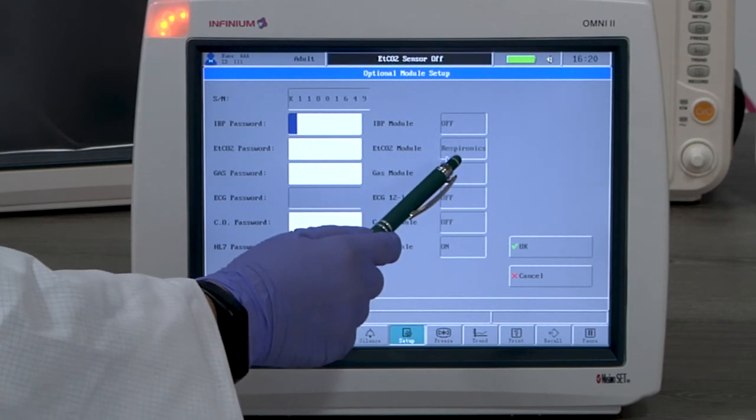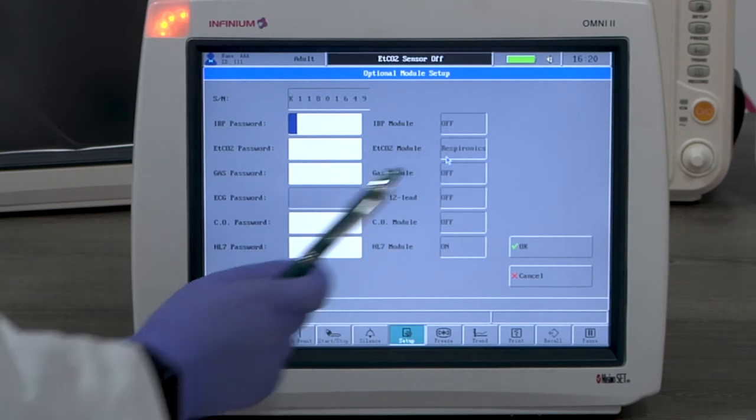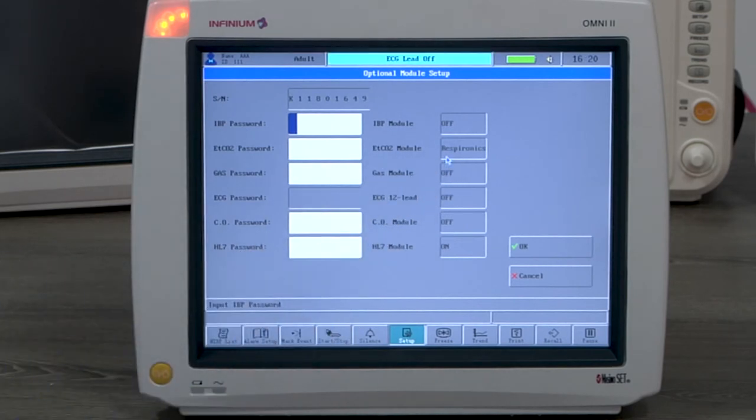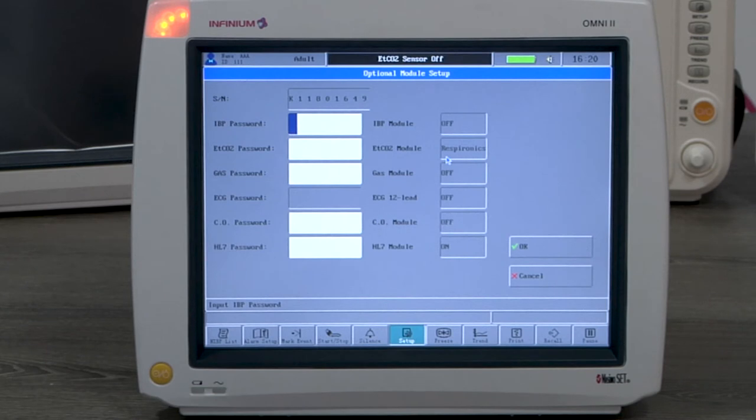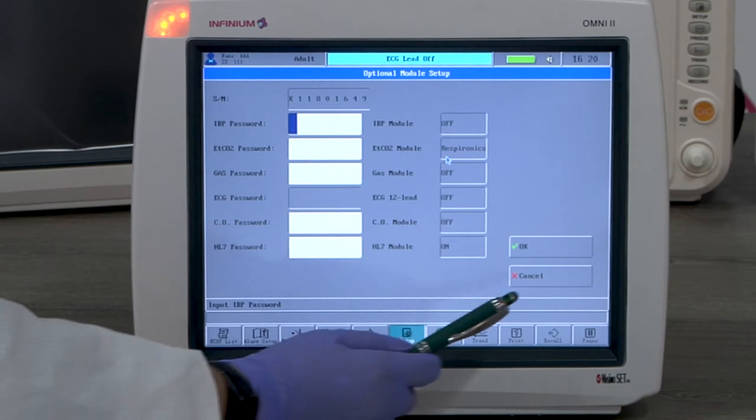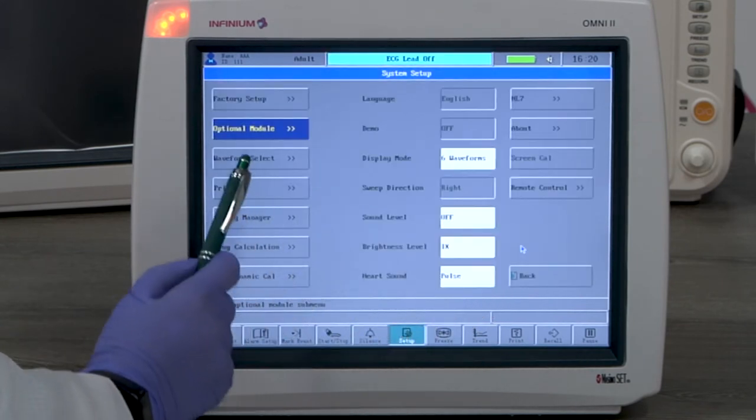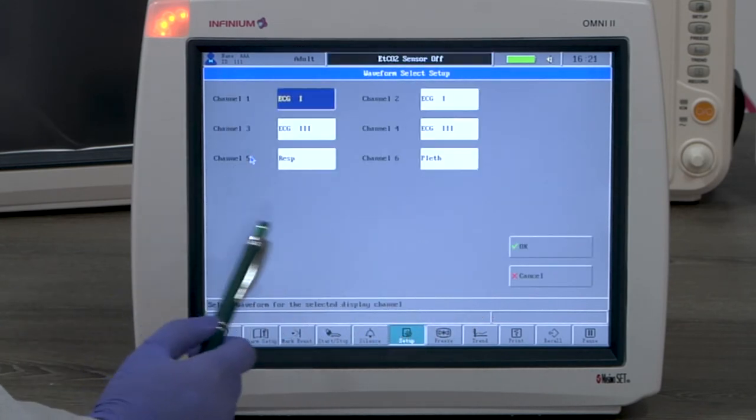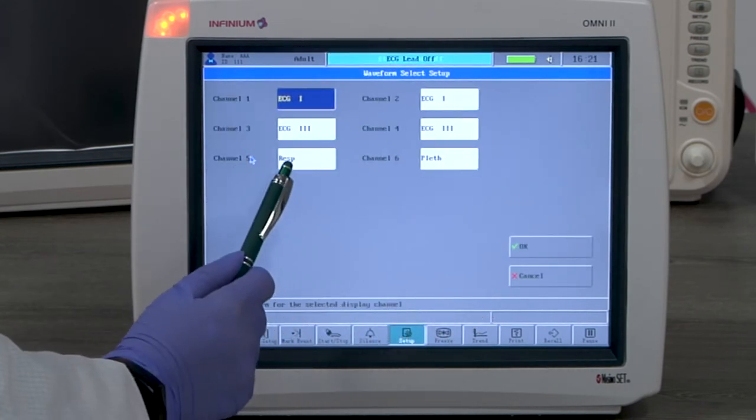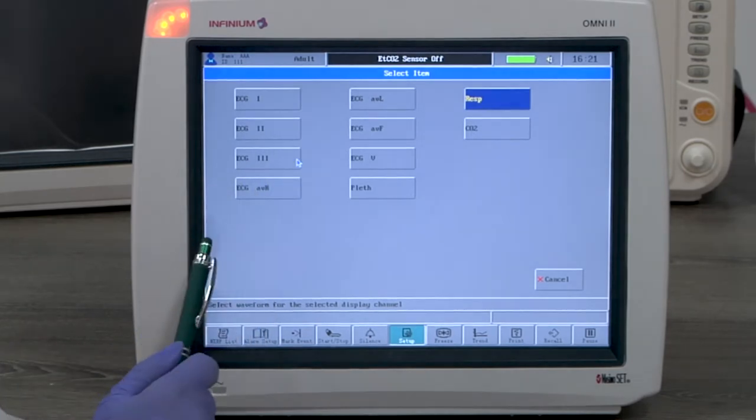This will be either respironics or phase-in. To avoid confusion, the CO2 channel and respiration channel cannot be displayed at the same time. To display CO2, we will replace the respiration channel as CO2.